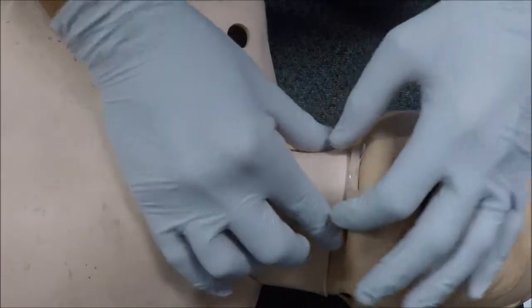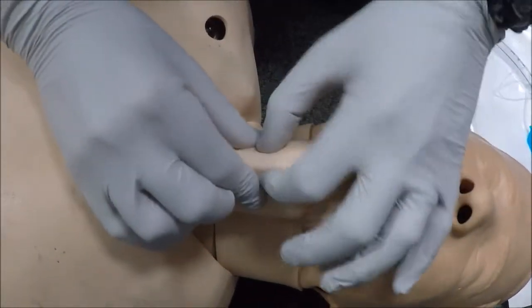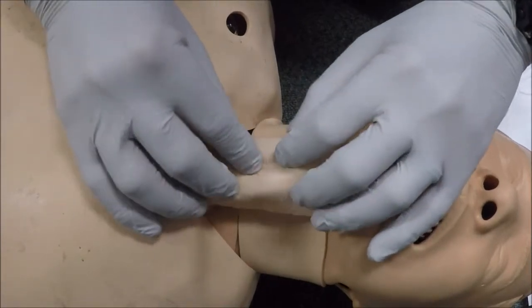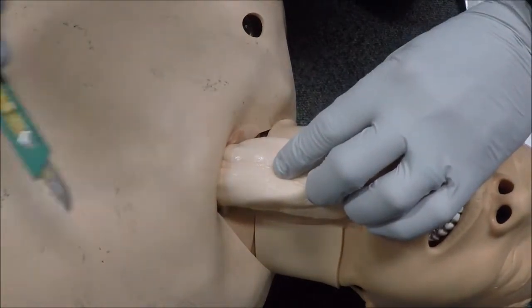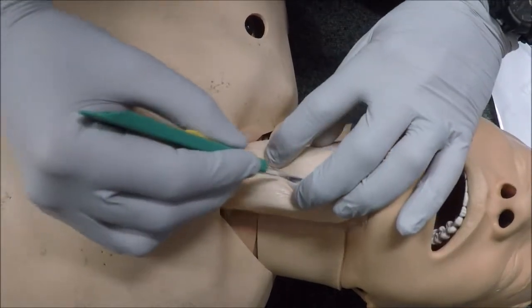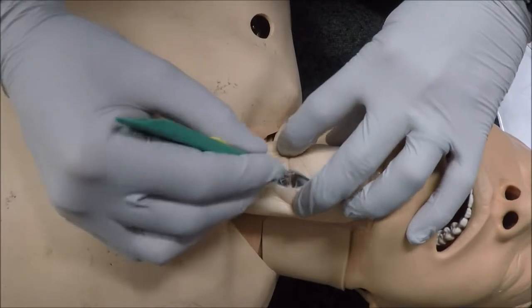Once again, demonstrating the laryngeal handshake, finding the hyoid bone, the thyroid cartilage, the cricoid cartilage, and the cricothyroid membrane, and locating with my non-dominant hand, using my surgical scalpel, and be aware that there will be blood because of the vascularity.